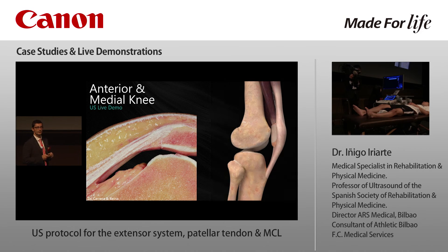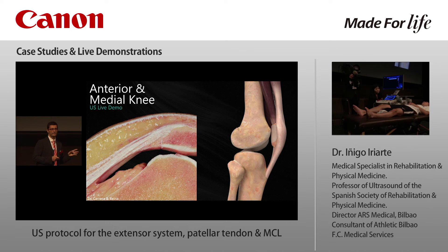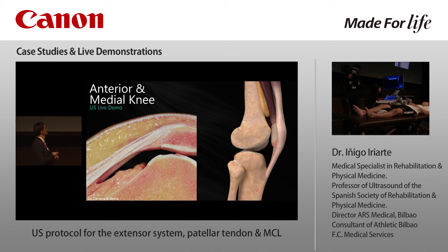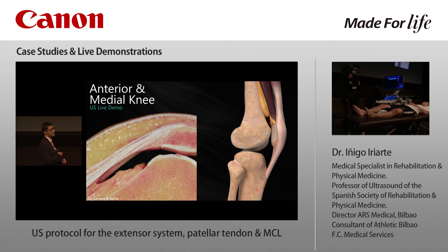Now we are going to see other structures: fat pads. There are two more fat pads in the anterior side of the knee — the prefemoral fat pad with its round shape and the suprapatellar fat pad with its triangular shape. Between these two fat pads we will find the recess of the knee joint, which is an important location for injections.